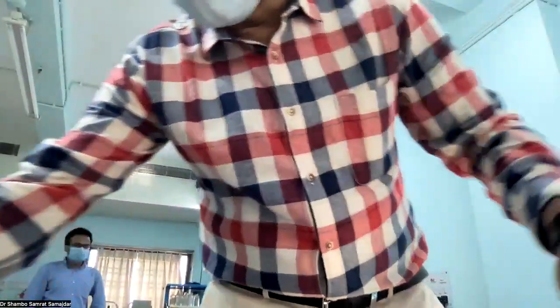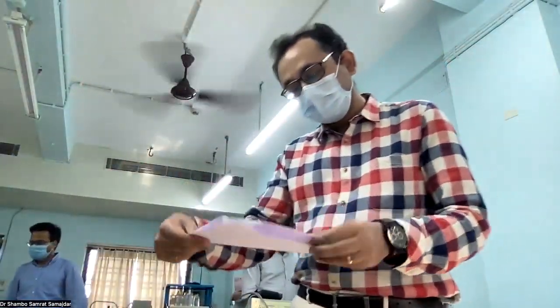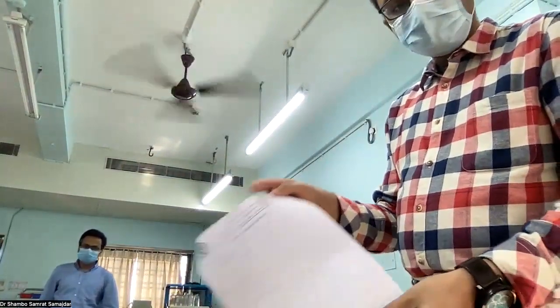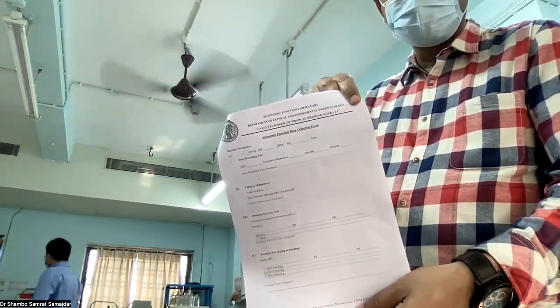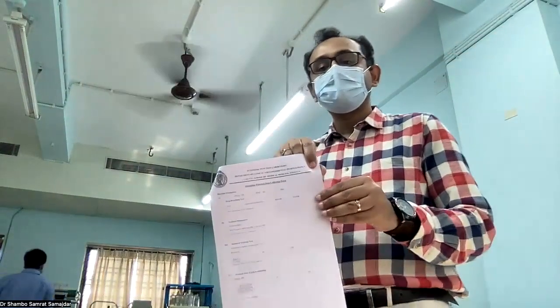And again, there is some form by which you can see this is the autonomic function details. We can put it in this after having the reports manually collected. We can also get results like that.